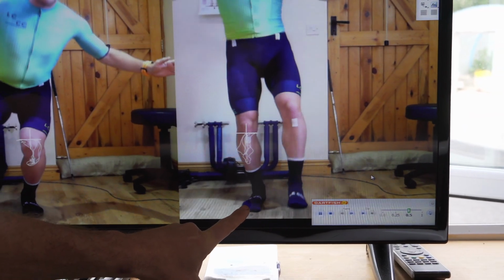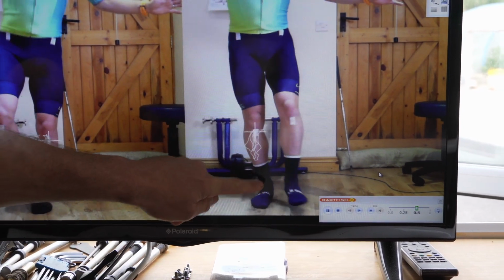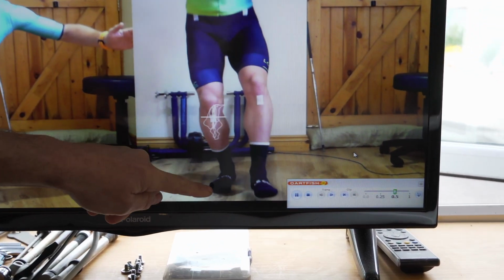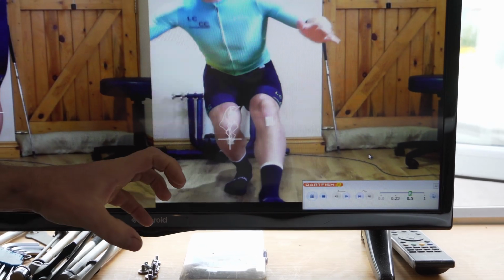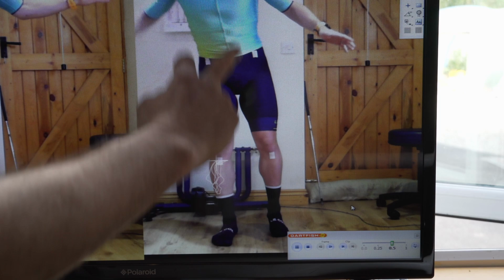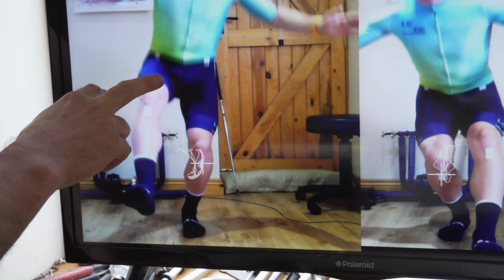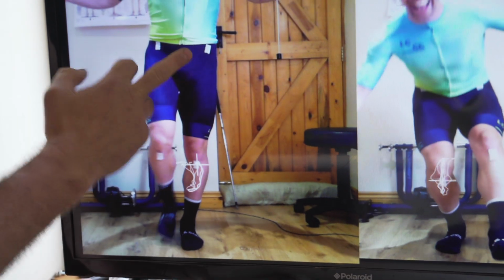Now he's more stable on his right foot, on his right leg, because it's his dominant leg, but look how his whole ankle from the rear foot is really collapsing and his toe is literally gripping the floor. But your right glute there, you're keeping your pelvis nice and still throughout. If you look at his hip, he's dropping his pelvis on the right hand side, so he's got a slight weakness on his right hip.